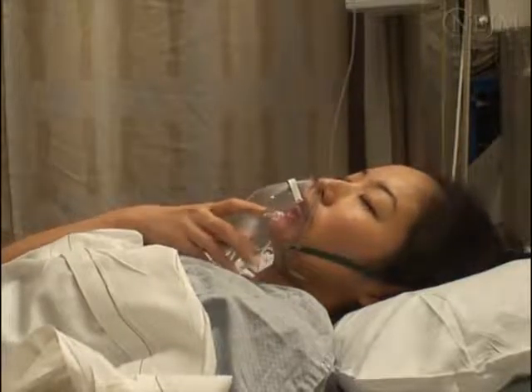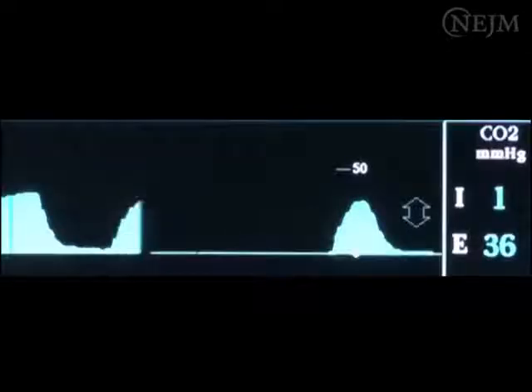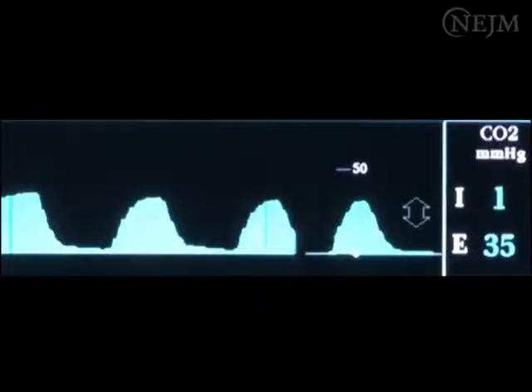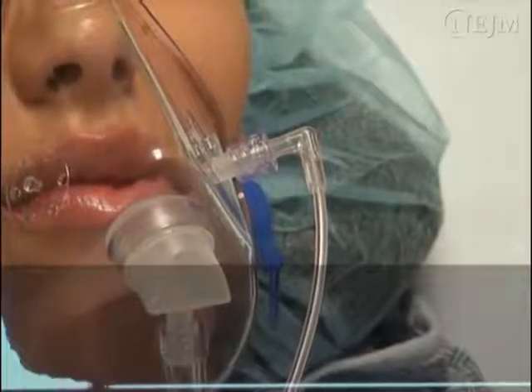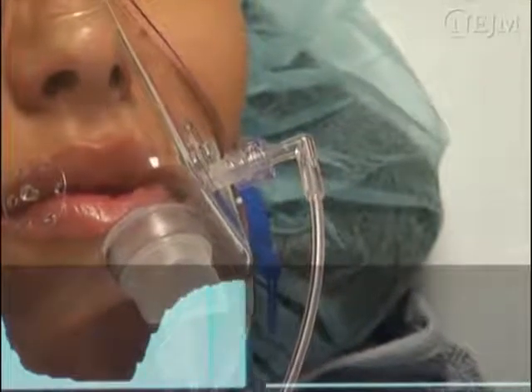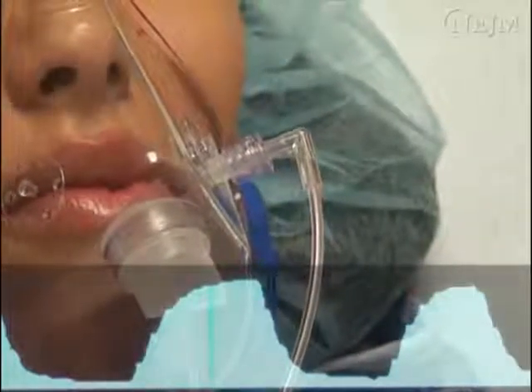As the side stream catheter is moved farther away from the patient's airway, the EtCO2 value will decrease progressively. Although the EtCO2 of a patient who is not intubated represents only a qualitative indicator of ventilatory status, the patient's respiratory rate can still be determined from the waveform of the capnogram.